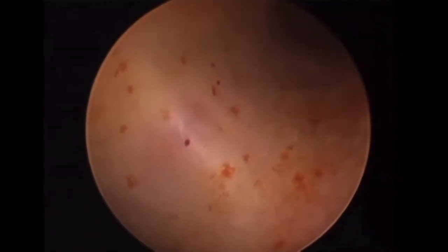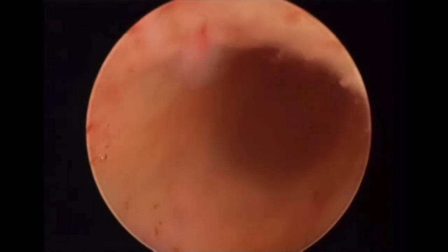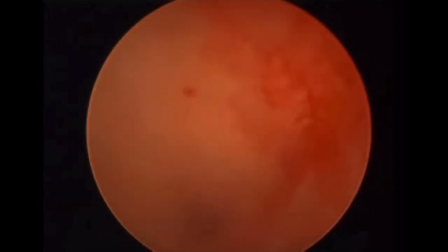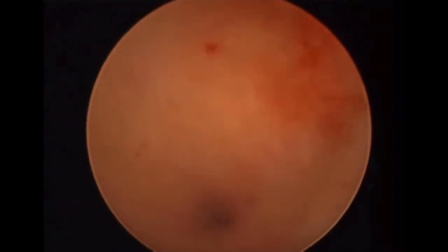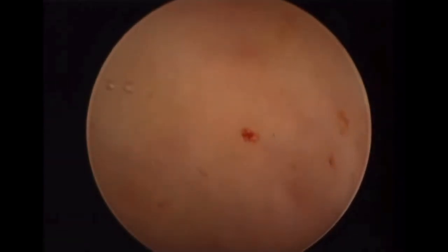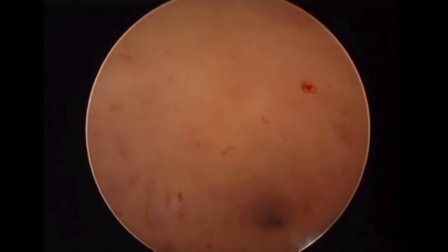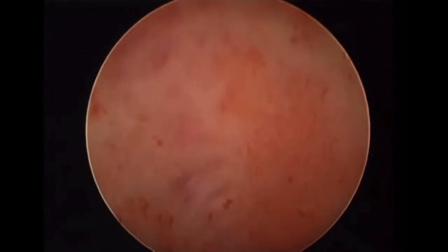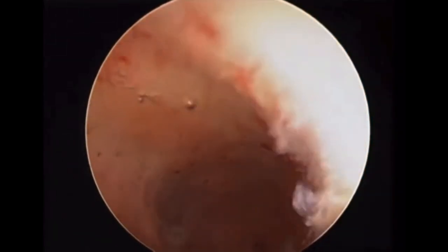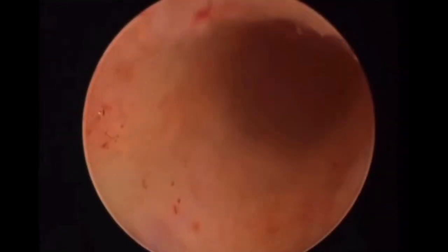Now — that's the septum. You can see that the endometrium overlying the septum is a little bit different than the rest of the endometrium. Some theories of recurrent abortion relate to defective endometrial covering of the septum. I'm still in the phase of cleaning the cavity — take your time. Hysteroscopy is not just a surgery; it's a strategy, planning, science, mathematics, and adjustment.